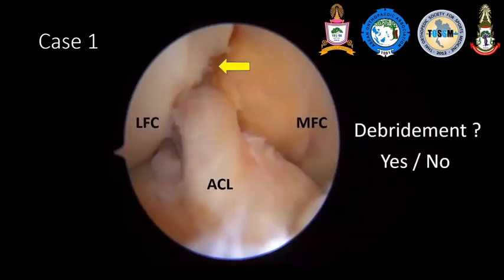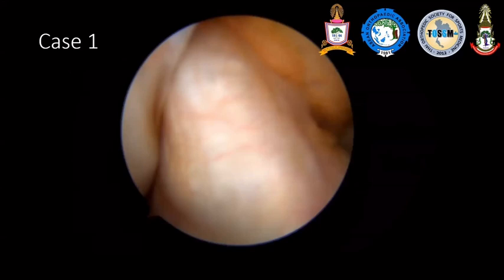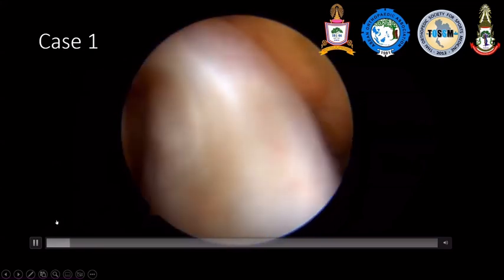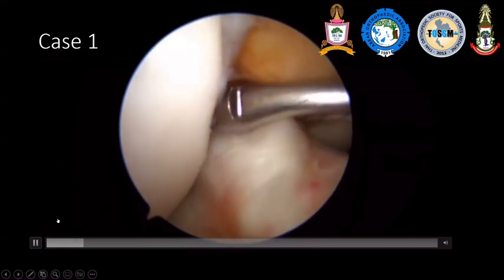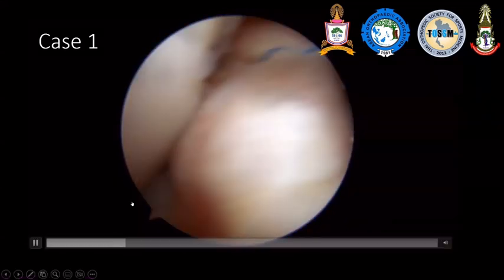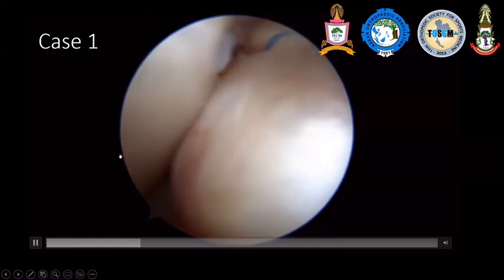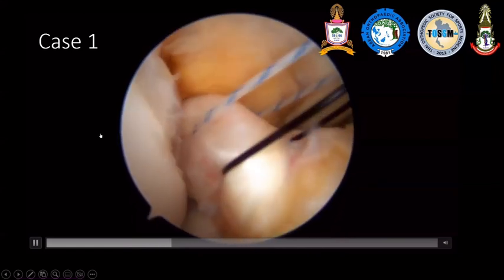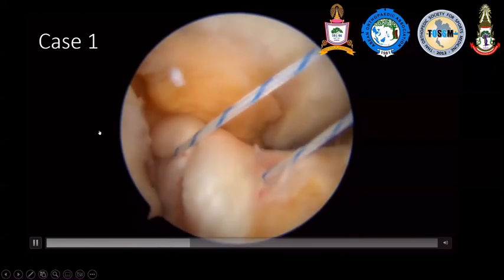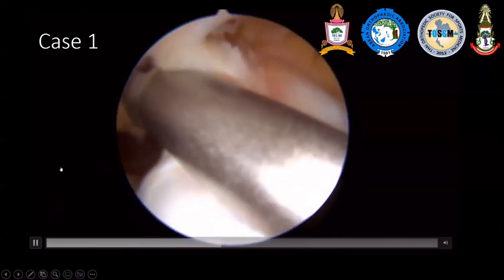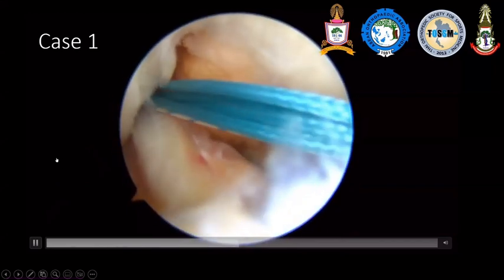This is the case I present. This was the arthroscopic visualization. After we probed it, we can see the substance is still there. We have evidence of ACL rupture on MRI, so we just leave the stump as a proprioceptive autograft, and we slant it with a strengthening suture.